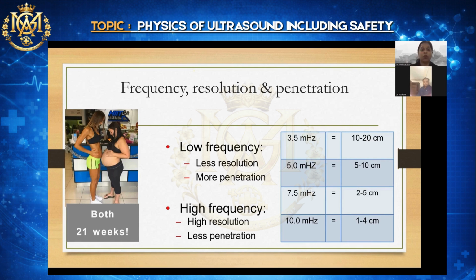No. Many a times, if the fibroids or any lesion of the pelvis is too big, what has happened and what I have seen in practice also, patient scan was done, reported left ovary not seen, right ovary normal, uterus normal. And because the abdominal probe was not put for that patient, the cyst which was there in the abdomen, which was very huge, was missed.